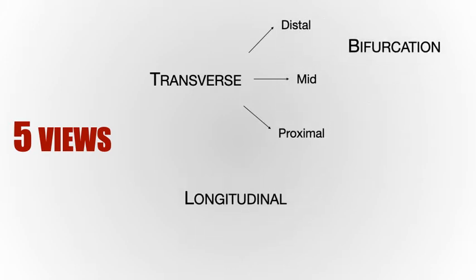Some choose to start at the distal aorta since the majority of aneurysms are infrarenal. Additionally, the distal aorta is more superficial and therefore may be easier to find. Bottom line is that you can start either proximally or distally as long as you evaluate the entire abdominal aorta.